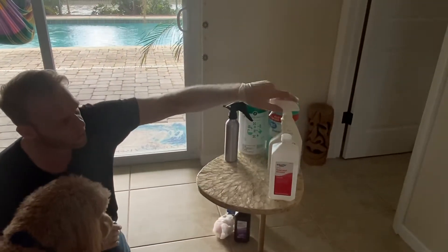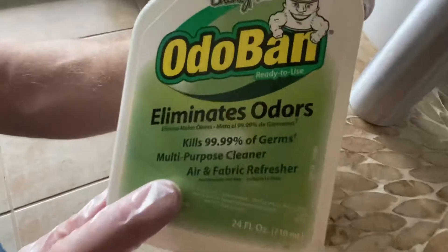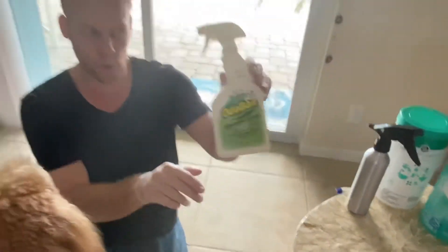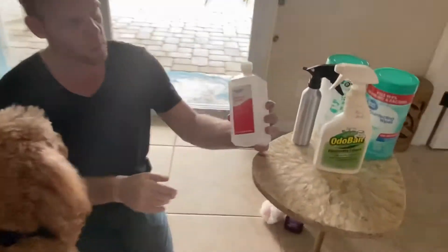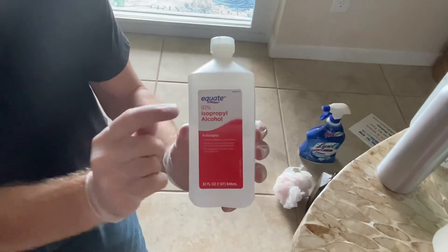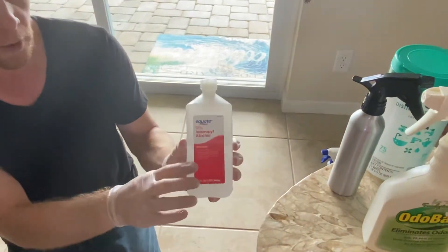We also have OdorBan, which eliminates odors and kills 99% of germs — it's good for air freshening and fabric, so it could be used on the seat. One of my favorites, and one of the most simple and versatile options, is isopropyl alcohol — as strong as you can get it. A bare minimum of 70%, and I have 91% isopropyl alcohol here.